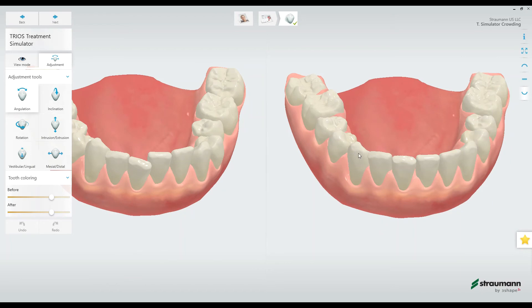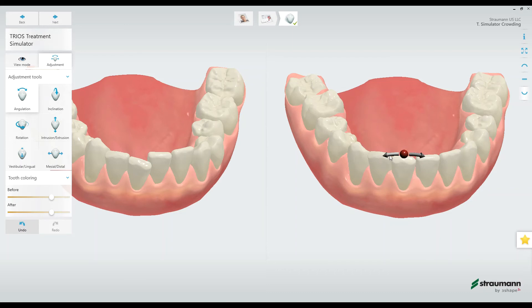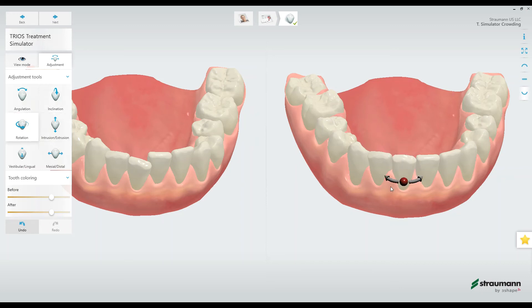Let's see what those adjustments look like. When I have the angulation selected, I can click on a single tooth and see adjustment options. I can grab the ball and move it left and right, or grab the arrows to do the same. I can also adjust the inclination, the rotation, and the intrusion or extrusion, and we see the animation change based on those adjustments.